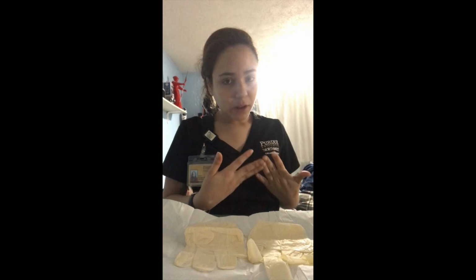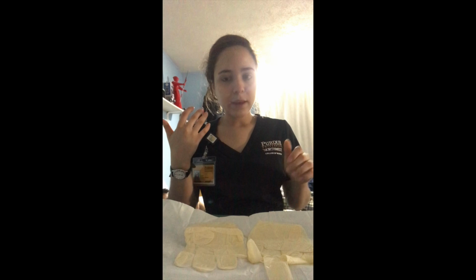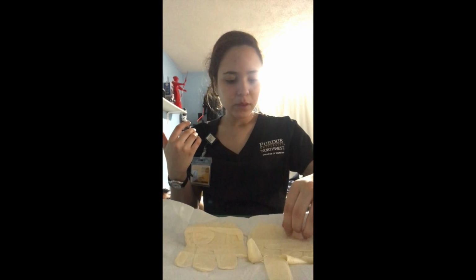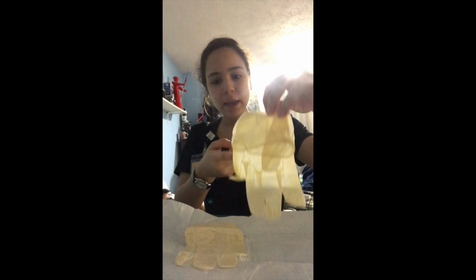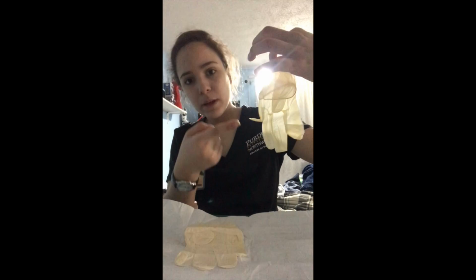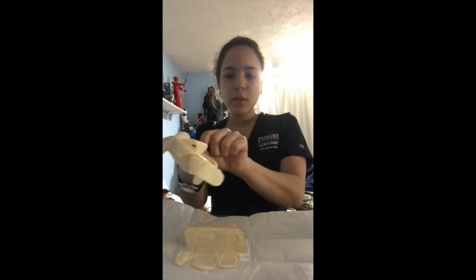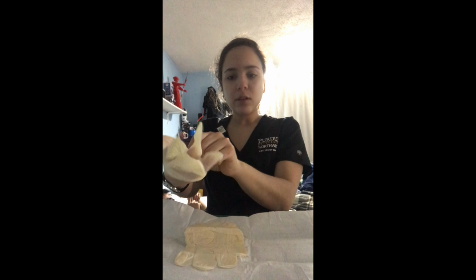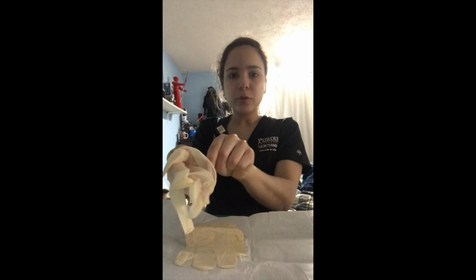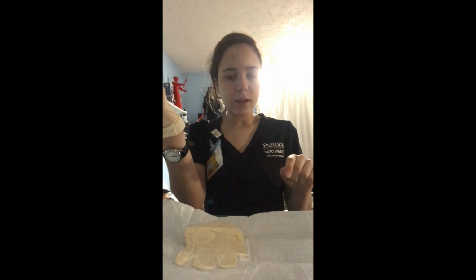So now I'm going to put on my gloves. I'm going to get my glove for my dominant hand with my non-dominant hand. I just touch this folded part, and I need to see where my thumb is. So my thumb is here. I'm going to put the glove on, making sure that I'm not touching the sterile part of the glove, and I don't fix it yet.